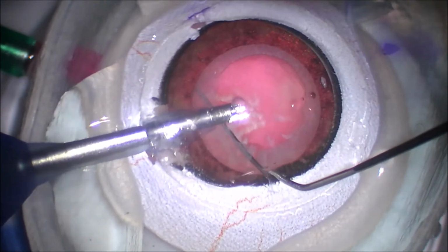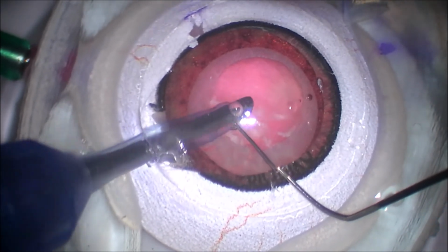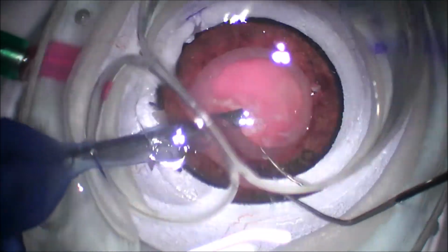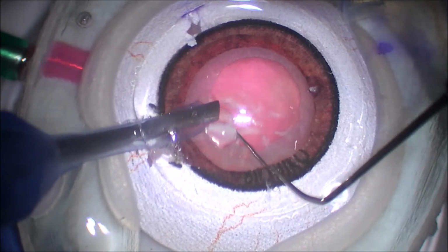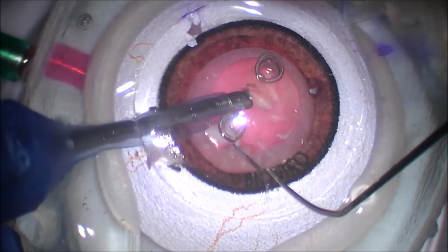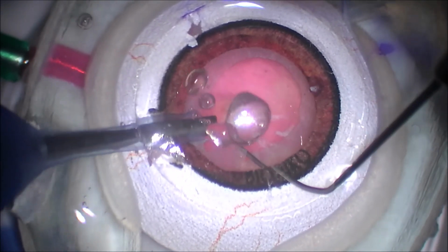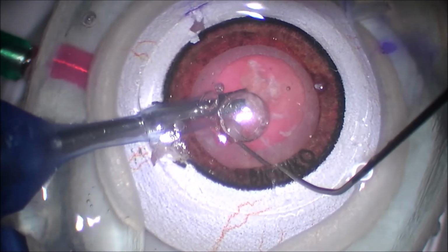So now that we've changed the bag, she's starting again. You see that, oh, there's a lot of bubbles. And that's because we had to switch out the bag. She's using the Maltzman to tease up that sub-incisional lens piece. I think that's excellent technique. And she loosened that sub-incisional lens piece up. And then she's able to grab it with the phaco handpiece and then emulsify the lens piece.